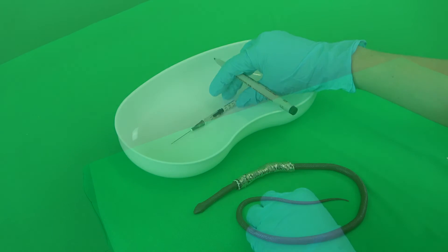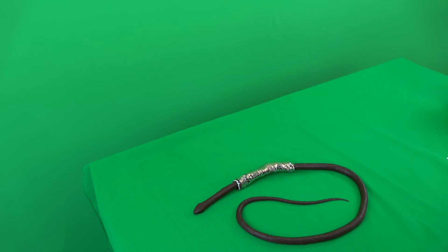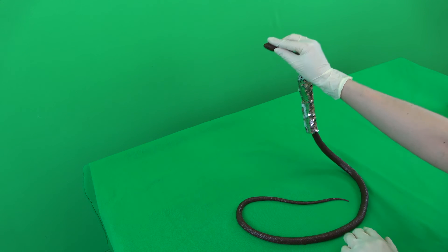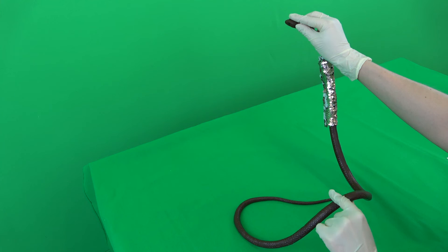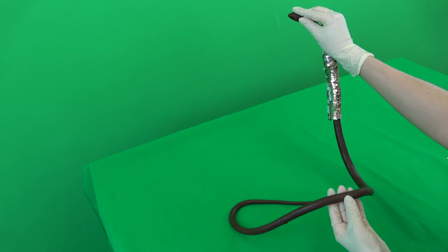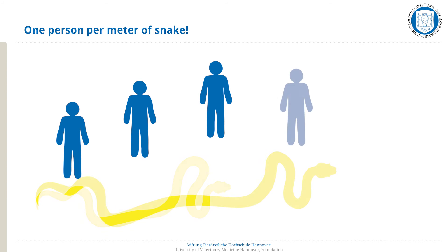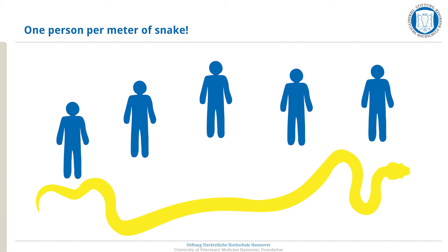When working with a live patient, the snake should be fixated in a hanging position by a gloved assistant. The head of the snake is held with two or three fingers behind the branches of the lower jaw. The second hand is used to fixate the snake's body. The 1 person per 1 meter snake rule should be followed to properly support and fixate the snake — the longer the snake, the more people are needed. When working with a simulator, no fixation by an assistant is required.